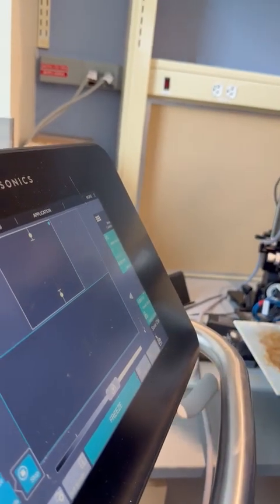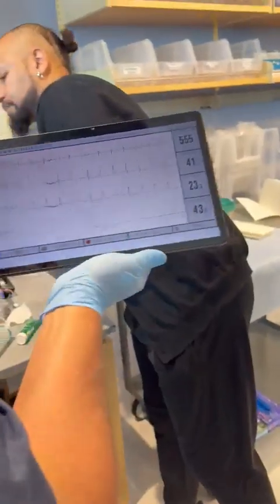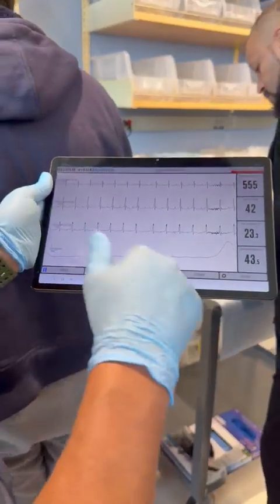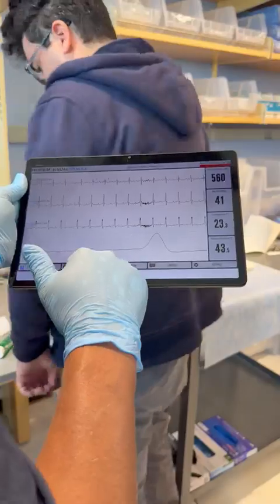You can change your display. So right now you have your different options. Can you do analysis on this? If you record, it's going to record until you stop, you can then get this data and analyze it in LabChart. In LabChart, correct. We can't do analysis on here.